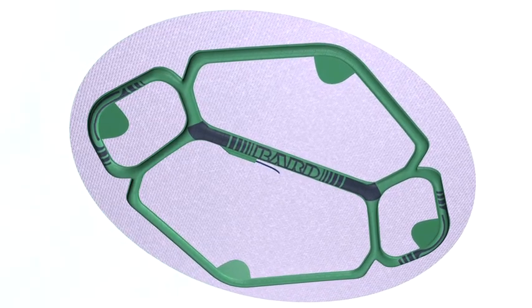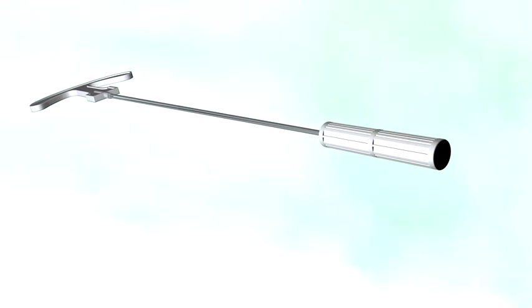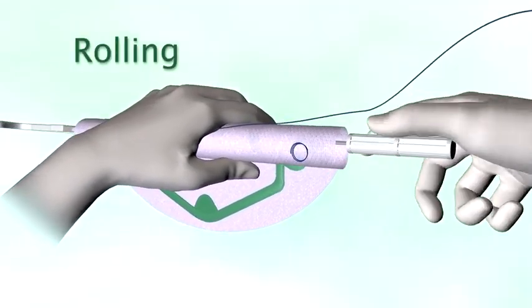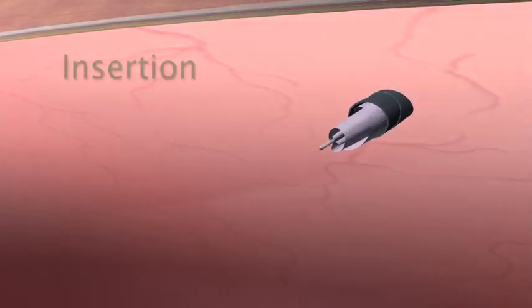Ventralite ST Mesh with the ECHO-PS Positioning System comes pre-packaged with an introducer tool. The introducer tool holds the mesh in place, ensuring a tight, uniform roll for ease of insertion through the trocar.